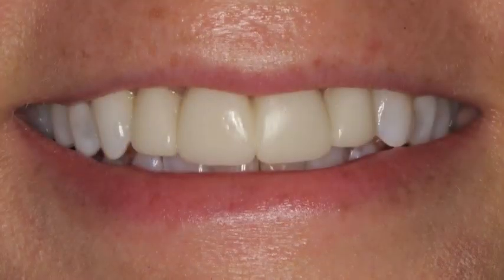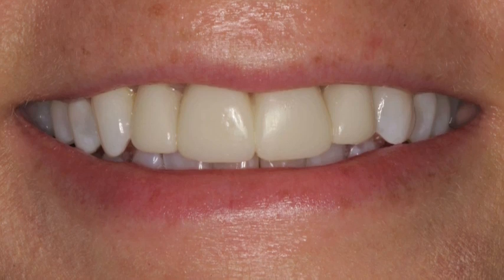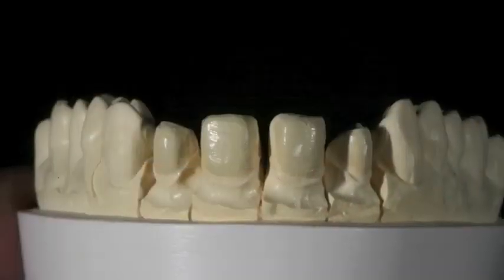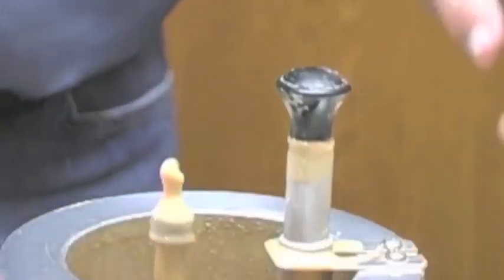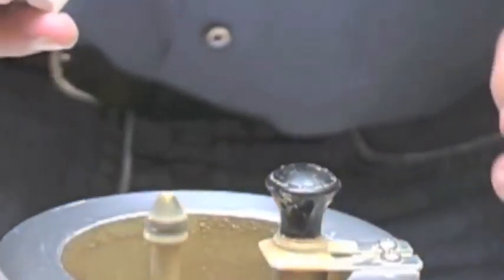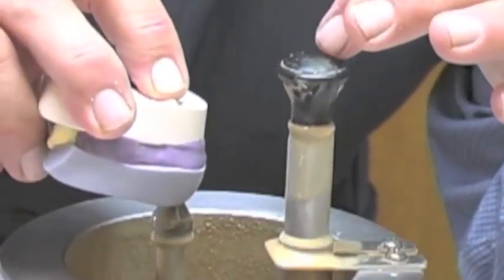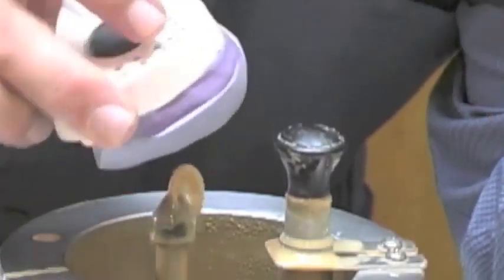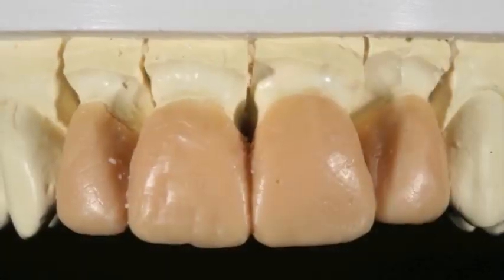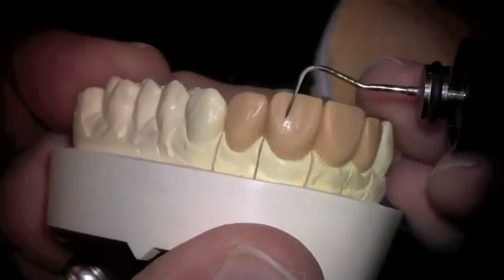Provisional restorations were made, and a stone model of these restorations was provided to the laboratory as a starting point for shape and form. A master model was created, and a Siltec matrix of the provisional models was placed over the master model, and then wax injection was used to transfer all the data from the provisionals to the master model. Here you see the initial result of the wax injection that has the incisal edge position and form.